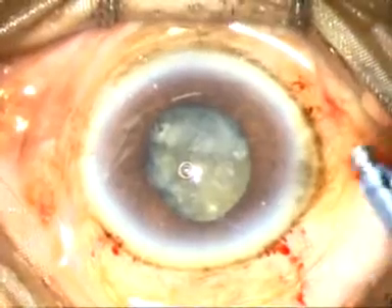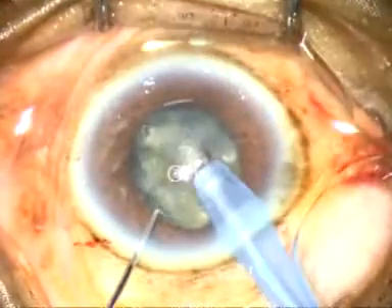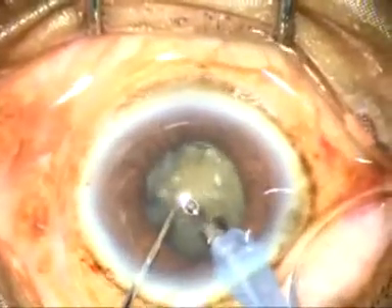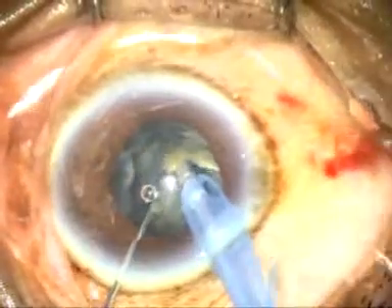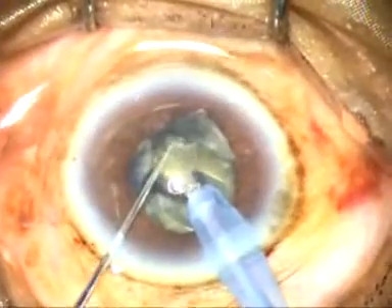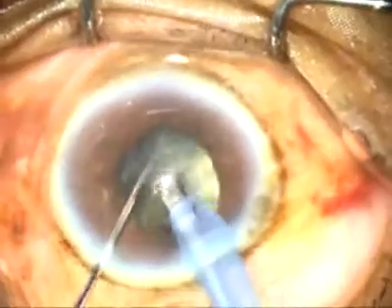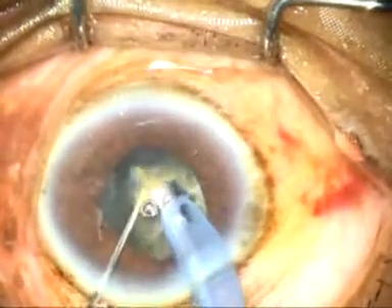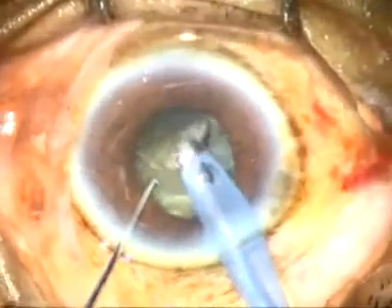Now it is time to introduce the tip of the FACO handpiece. In this case I have to do a vertical chop because I cannot go to the periphery — I can't see the rhexis margin and I can't do horizontal chop. To do vertical chop: hold the nucleus right at the center, embed the chopper just in front of the FACO tip, and divide the nucleus anteroposteriorly. Place the chopper just in front of the FACO tip and divide it — this is vertical chop.